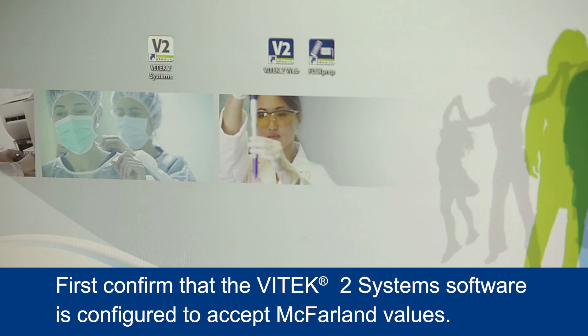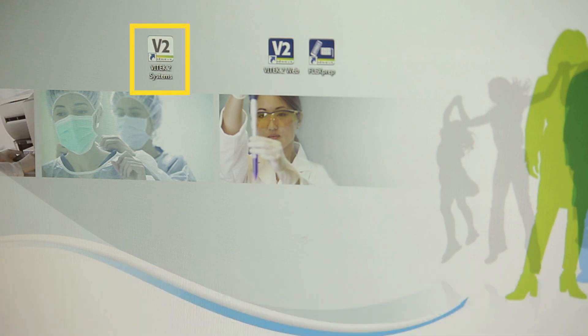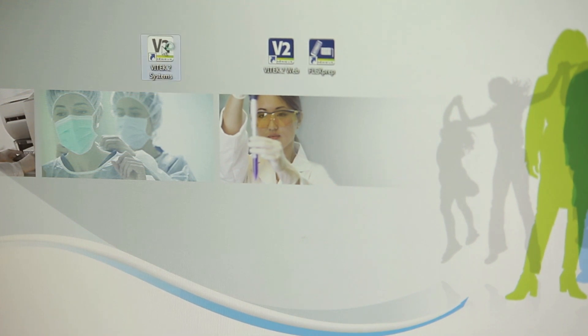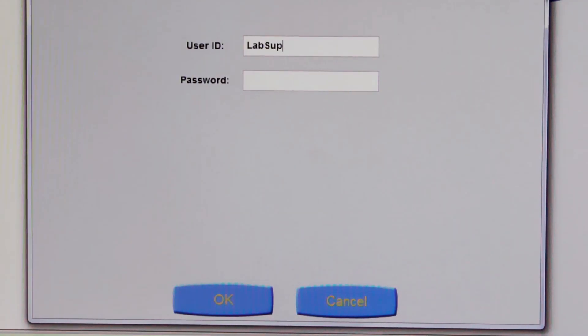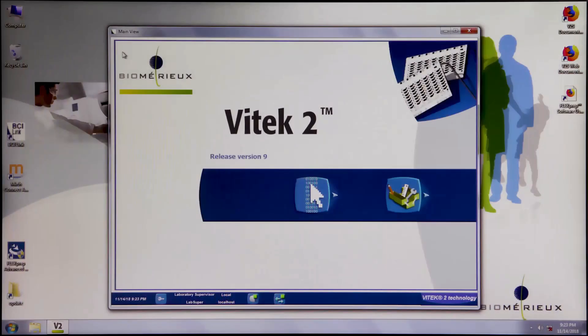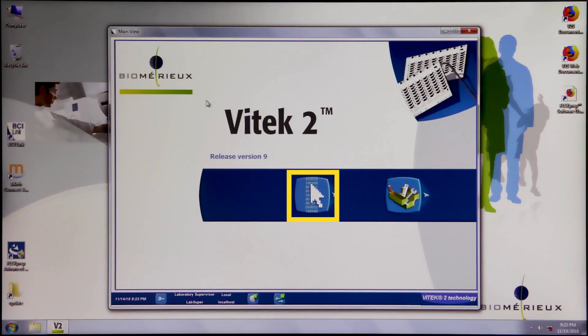First, confirm that the Vitek 2 system software is configured to accept McFarland values. Double-click the Vitek 2 Systems icon on the desktop of the PC. Log in as a supervisor or administrator. From the home screen, click the configuration view icon and select General Configuration from the drop-down menu.